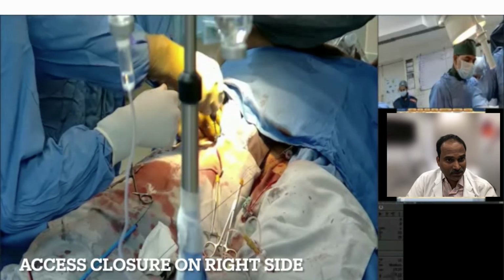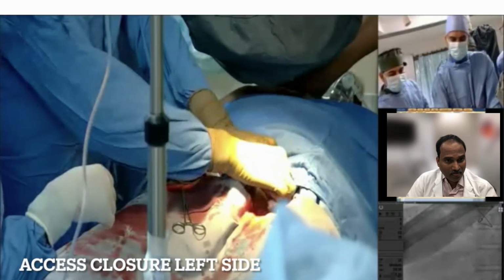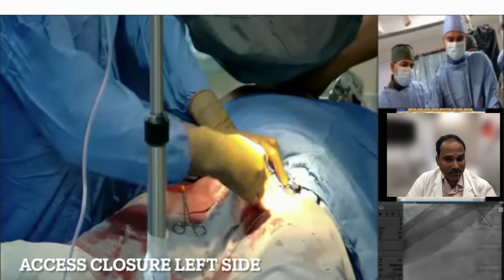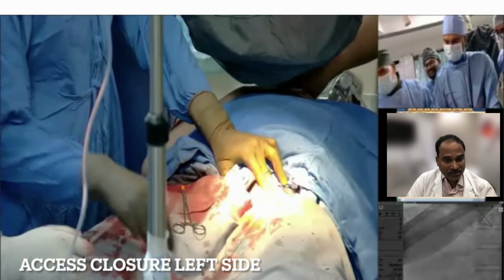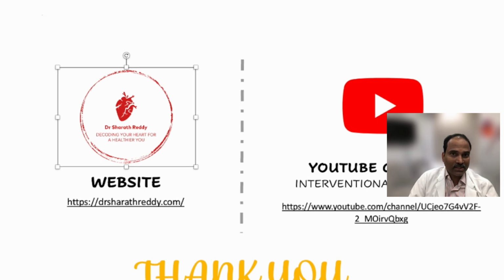Though we placed two ProGlides, we used only one as bleeding stopped with one ProGlide, so we didn't use the second, because the femoral artery size was only around 6 millimeters. Using two ProGlides can cause stenosis. So that was about the case.